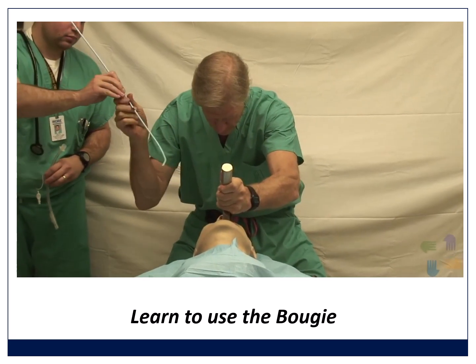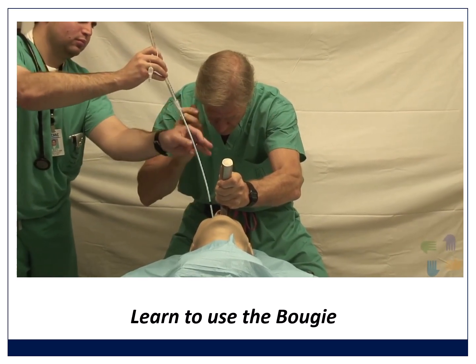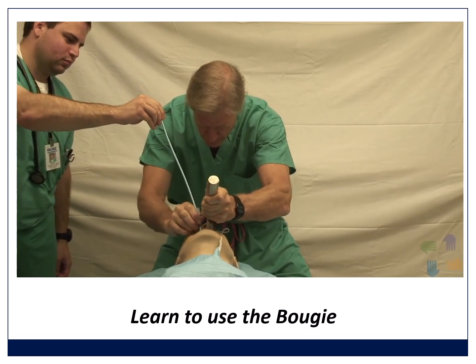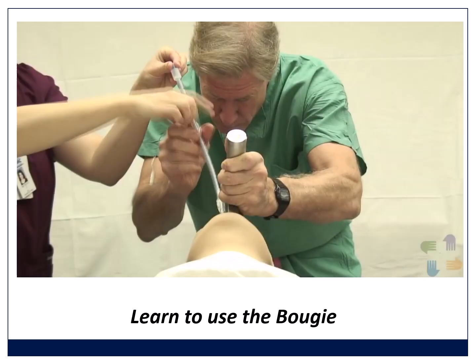As he's got his nice view, he gets the assistant to hand him the bougie, that goes in, he's now intubated, feels it stop, the assistant loads the tube, he takes the tube, the assistant takes the top of the bougie and he pushes it in. Now they're going to show that to you again, a little bit slower. That's all quite rushed. Just watch, there's a special thing that he does here.